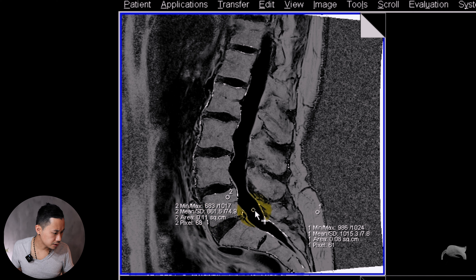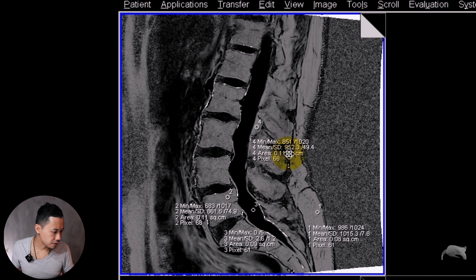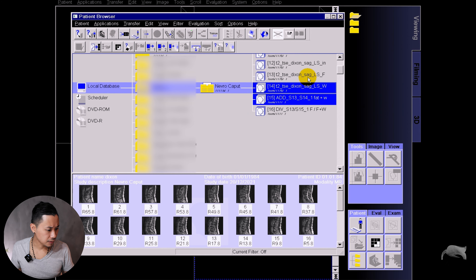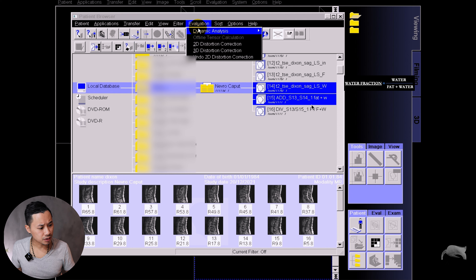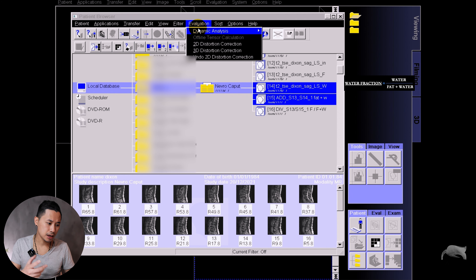Now we can do region of interest measurements. Let's put it on the fat there — it says 101, so that's 100% fat, which is correct. Let's put it there — about 86. Let's put it in water — not much fat there, which is correct. Let's put one there — 95. So this is very good. If you have a lesion and you're wondering how much fat is there, you can do a quantification. It's a very easy step and you can send it to PACS.